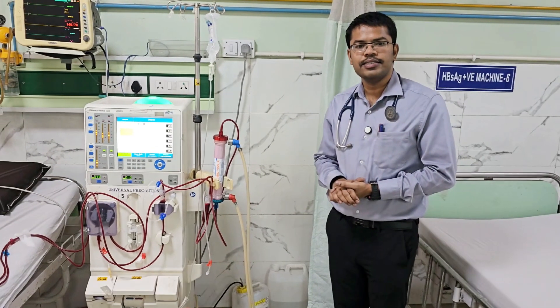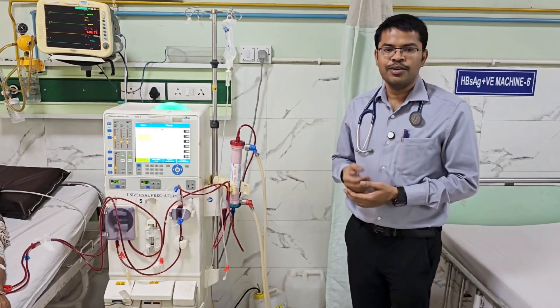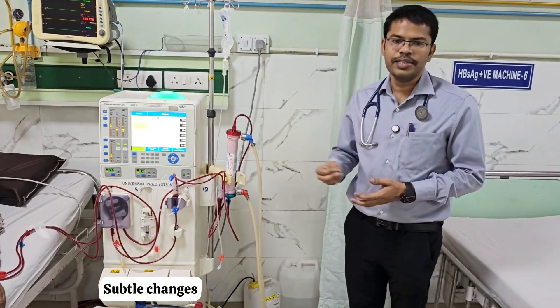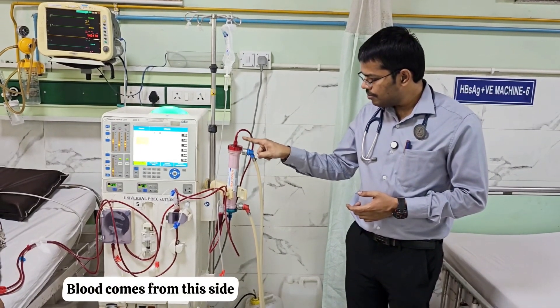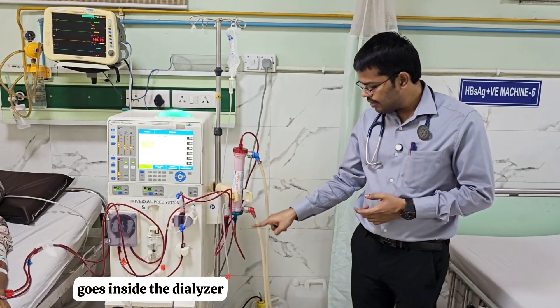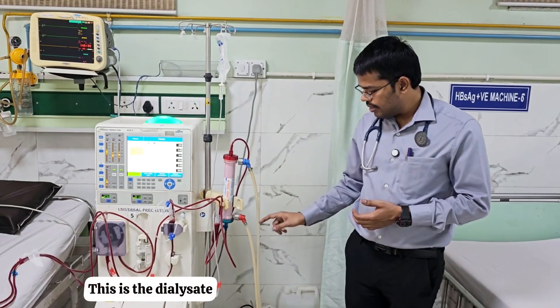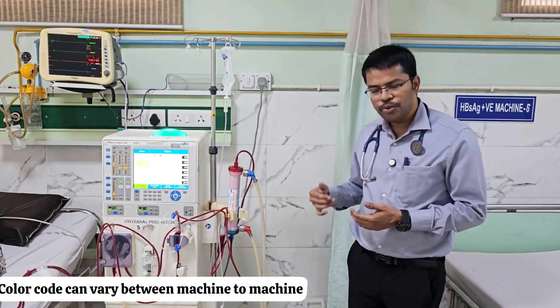In this hemodialysis series, today we will cover a simple topic: what is co-current dialysis and what is counter-current dialysis. In this dialyzer, blood comes from one side, goes inside the dialyzer, and goes back to the patient flowing in one direction. The dialysate flows as well — let's leave out the color code as it can vary between machines.